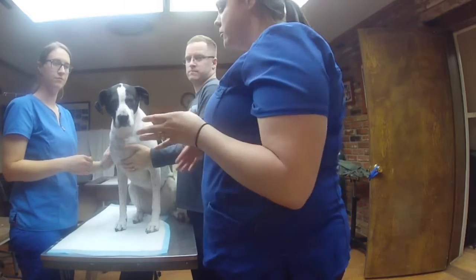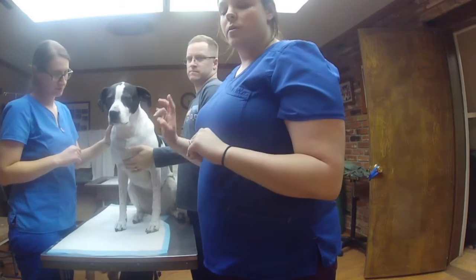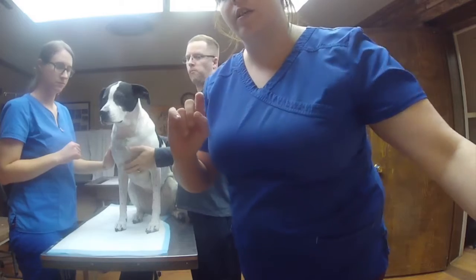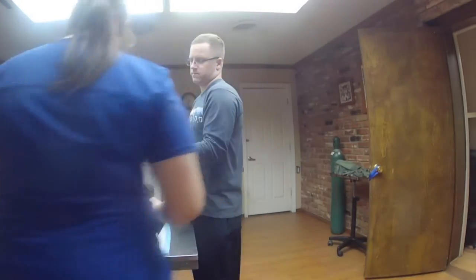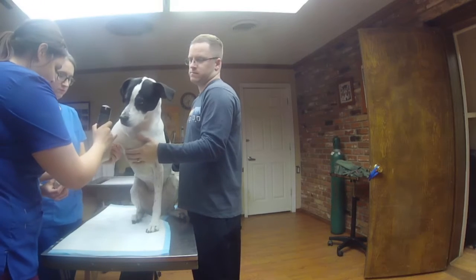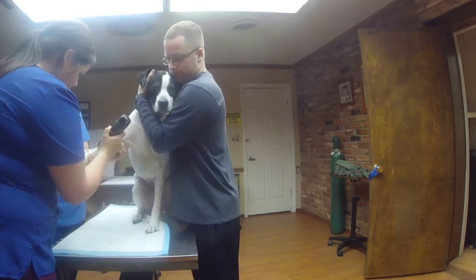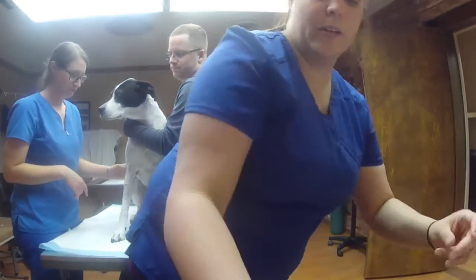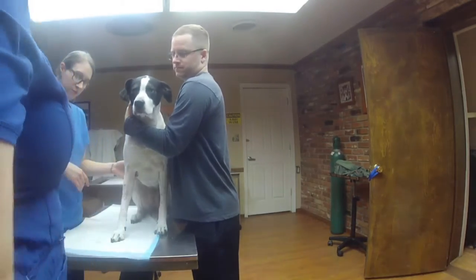This is my preceptor, Jessica. She has been helping me along the way, and she's going to help me today, showing the IV catheter placement. So first, you're going to want to shave the leg of choice. You're going to want to make sure you get all the hair off, and then you're going to want to clean it with an iodine scrub.